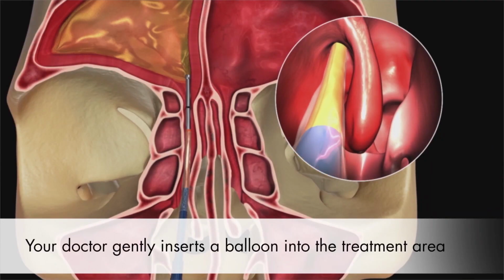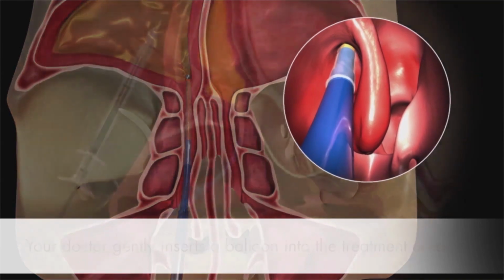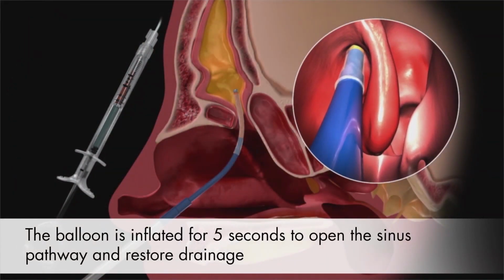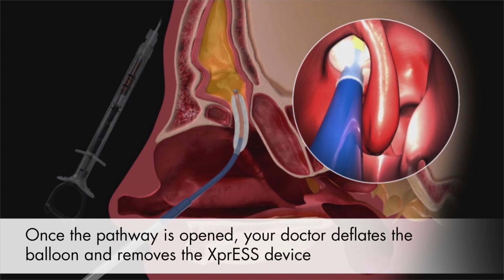Balloon sinuplasty is when we take a rubber catheter and inflate it in the nose for a few seconds. It doesn't stay in the nose. Typically it's used to make narrow sinus passageways more open. We say a patient is a candidate for that when they have chronic symptoms such as headaches, pain in their face, pain in their cheeks, or tooth pain that doesn't respond to the traditional techniques of nasal sprays, saline irrigations, or antibiotics. We'll utilize this technique so that we can allow their sinuses to drain more appropriately.